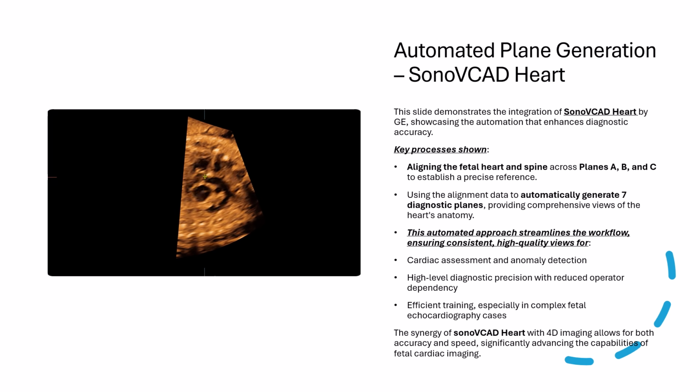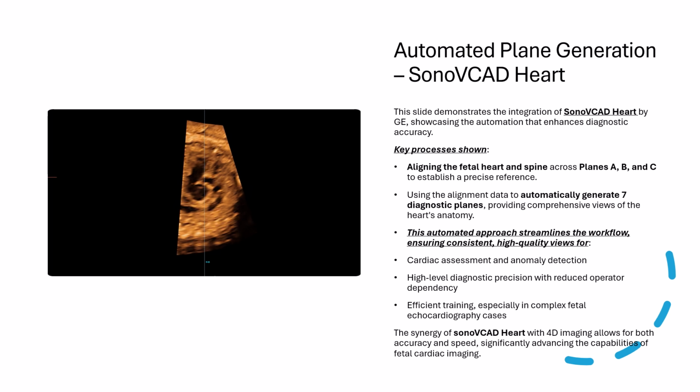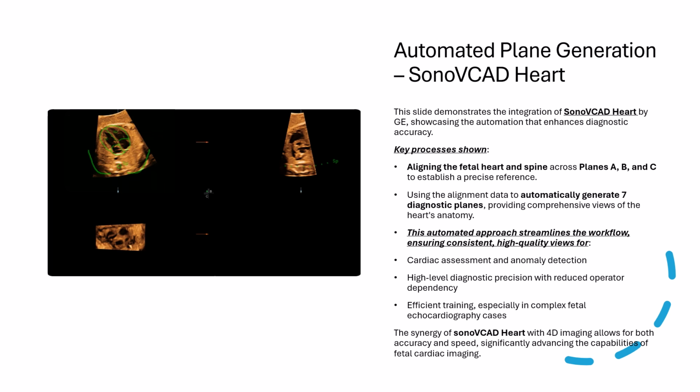Sometimes it takes a combination of manual navigation to the acquired plane using Sono-VCAD Heart. But yet, practice makes perfect. The more optimal the volume acquisition is, the more expertise you will acquire in the alignment system, and you will get the perfect results from Sono-VCAD Heart.